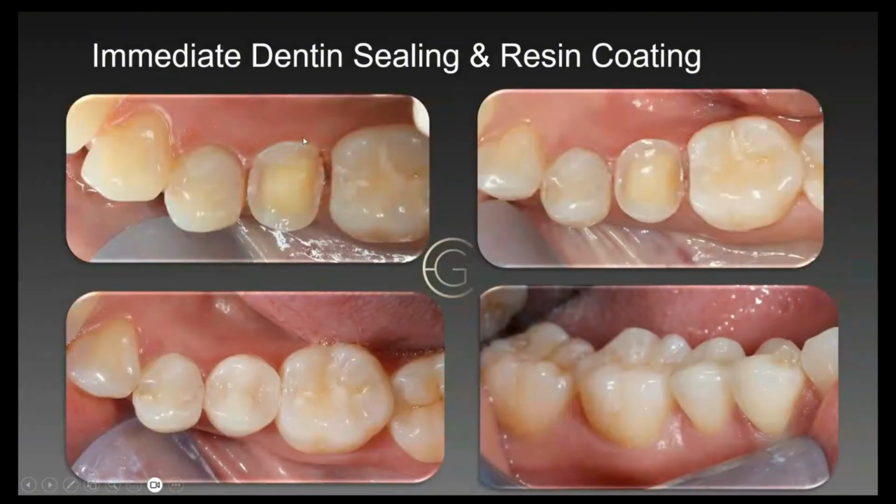All right, so here's another case. Now that I explained it, I did this one. I didn't nick this tissue, but you could say I did. That's a laser. This is when I still thought I had to do a little bit of retention here. This is the coating all the way done. And look at the chameleon effect I got on the lower right. That case turned out really well. I got lucky. So I'm showing you the good, the bad, and the ugly.